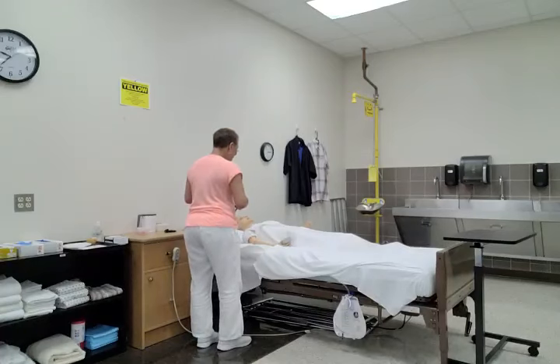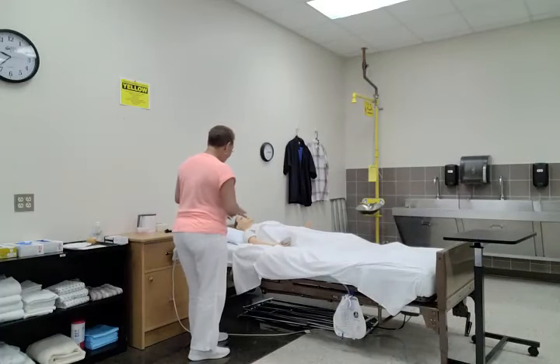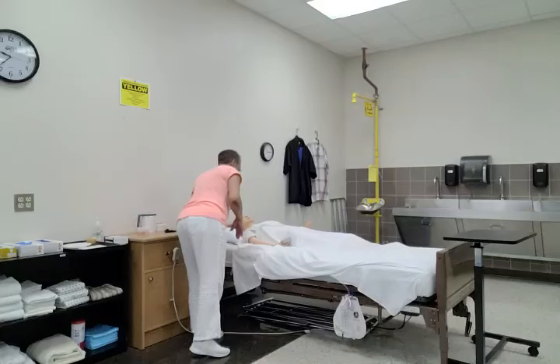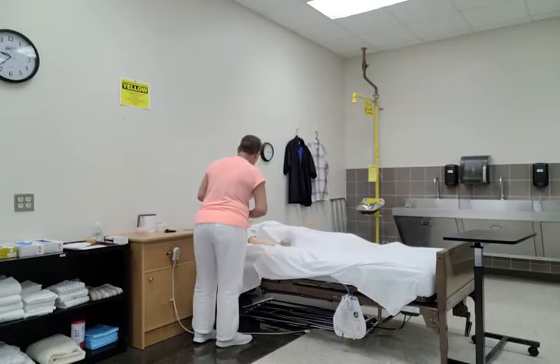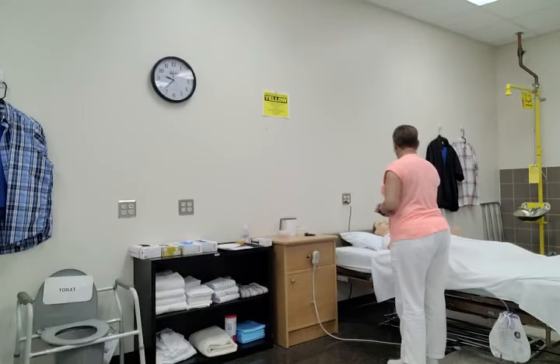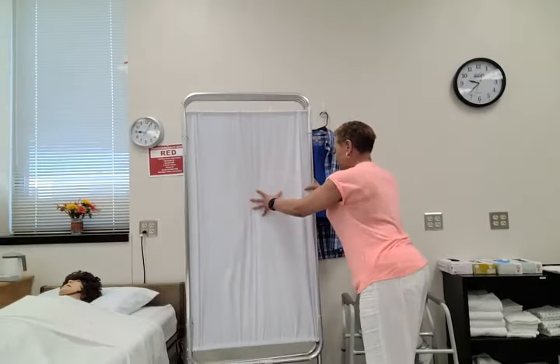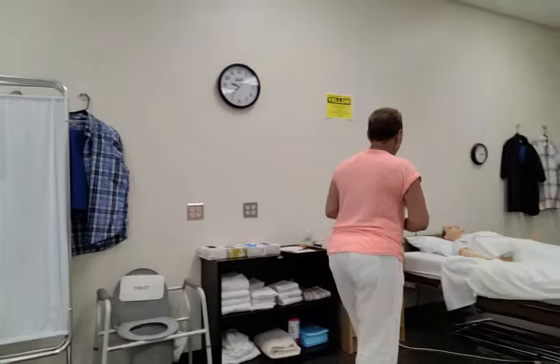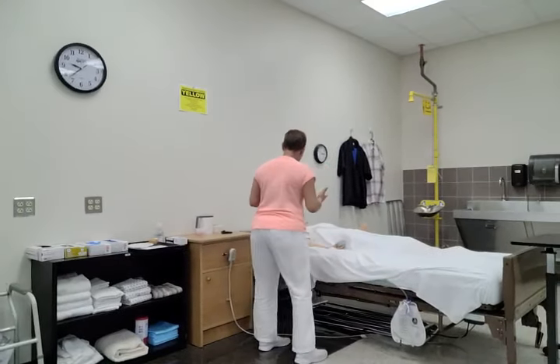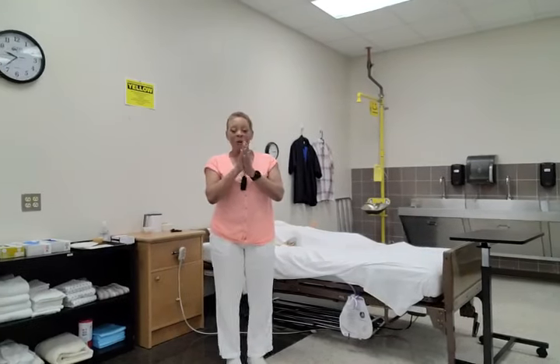Is there anything else I can get for you? Well, before I leave, I just want to make sure that your bed remains in a low safe position and bed wheels are locked. You still have your call light here — just press that button if you need anything. Would you like for me to keep your privacy curtain open or close it up? Mrs. Jones, if there's nothing else you need, I'll leave and you have a great day. Washing hands — skill complete.